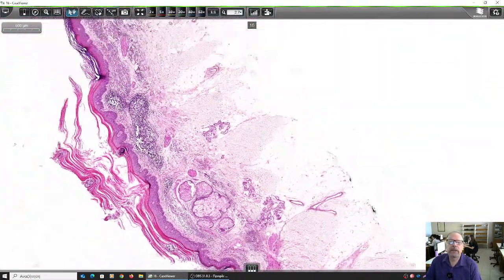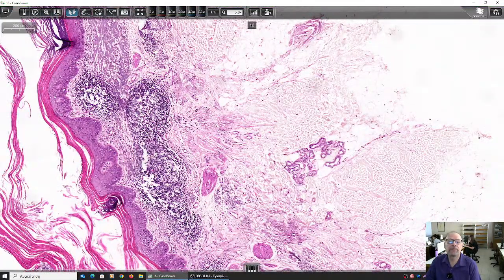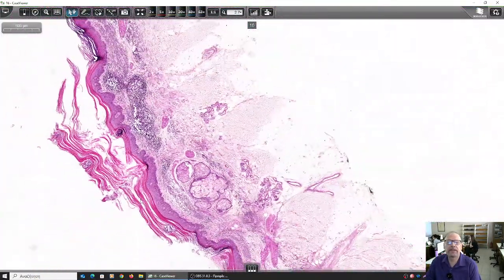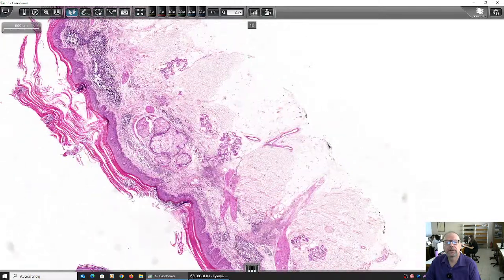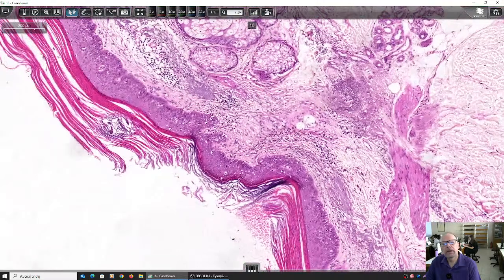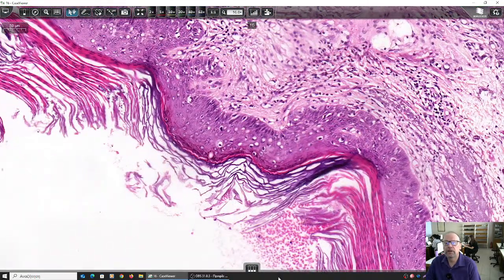So what do we see here? We see the dysplasia, no signs of invasion, the basophilic degeneration of the dermis, the lymphocytic infiltrates, and the thickened superficial layer of parakeratosis, which, in some areas, transforms to areas of hyperkeratosis. This is parakeratosis, this is hyperkeratosis. That's all.